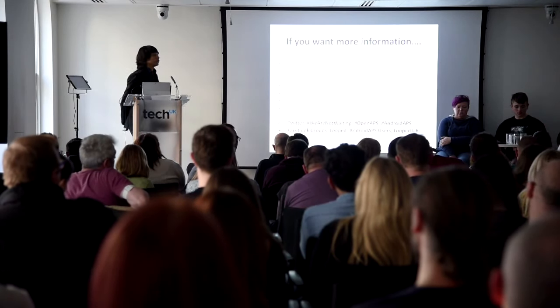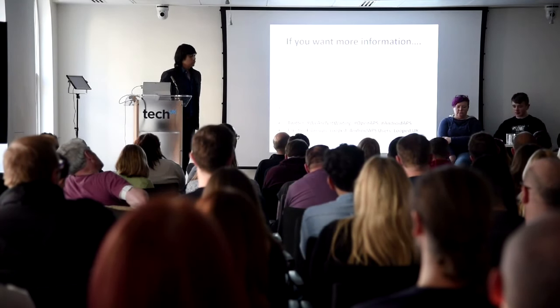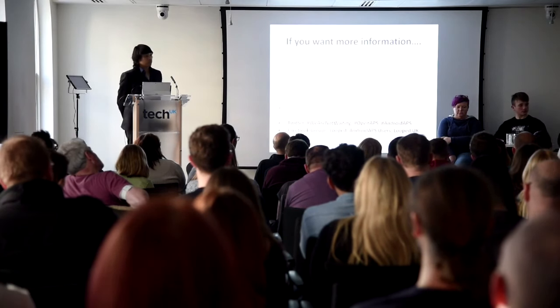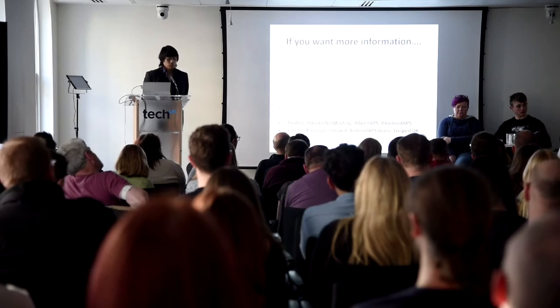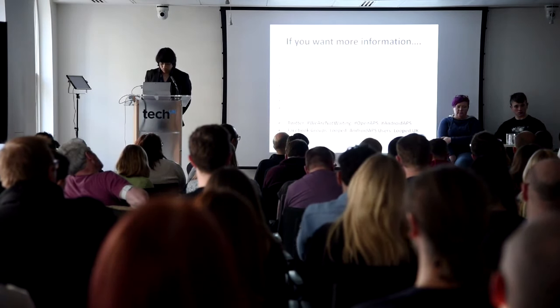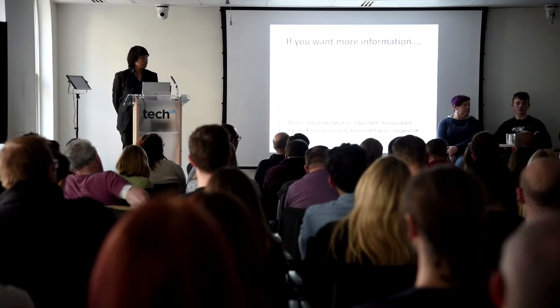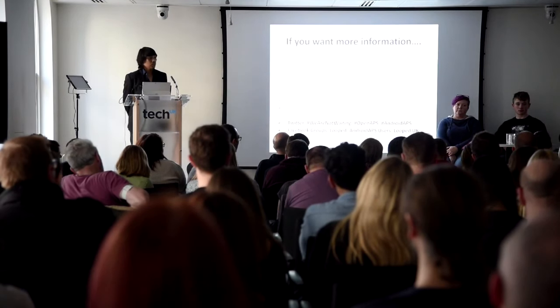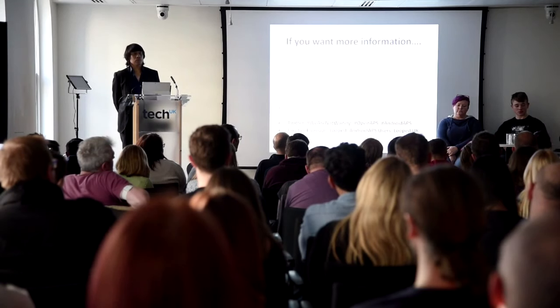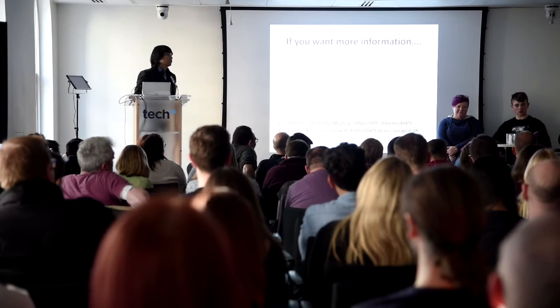So there are tools to help with carb ratios and bolusing, and also with how you bolus for things that are more difficult to deal with, like, as I mentioned earlier, the fat protein unit model from Warsaw. There's a shortcut on your iPhone, and you press the button on it when you put the data into it about the food, and it will put the carb amounts into Nightscout or into Loop, the equivalents needed to enable an APS system to give you insulin to keep you flat-ish, for want of a better term.